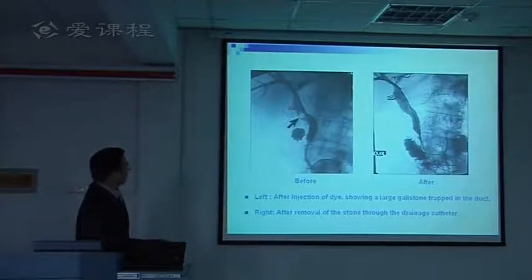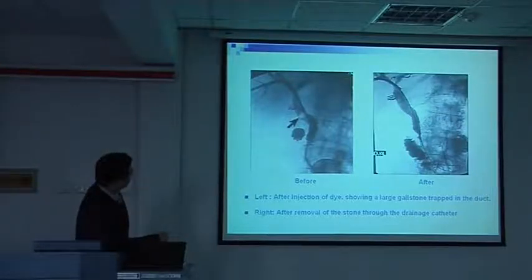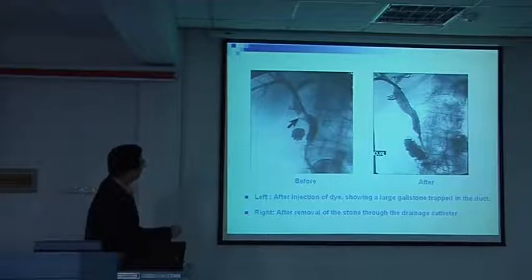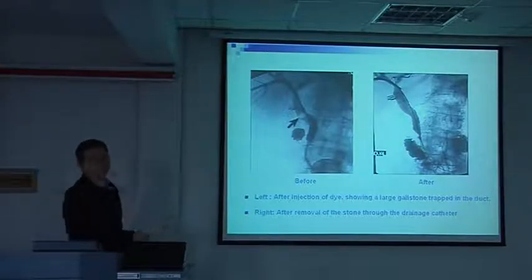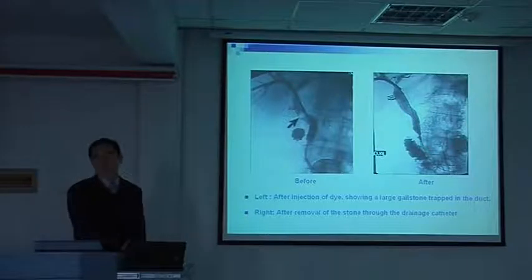This is another PTCD. We showed this is the catheter from the skin to the intrahepatic duct. But we found a stone in the CBD. So we can try to draw out this stone through the catheter after PTCD. This is a very good method for treating CBD stone.